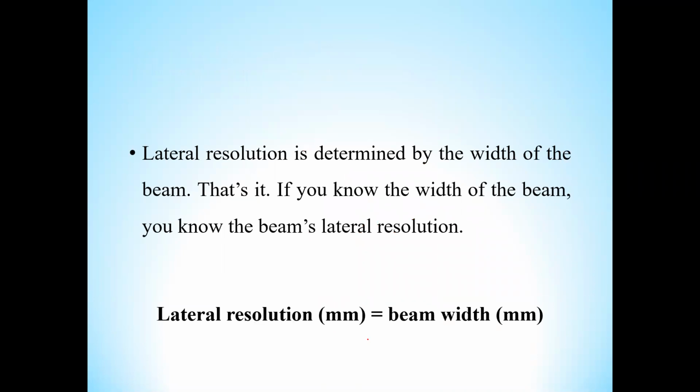Lateral resolution is determined by the width of the beam. So you can say that lateral resolution is directly related to beam width. So axial resolution is related to SPL, and lateral resolution to beam width.